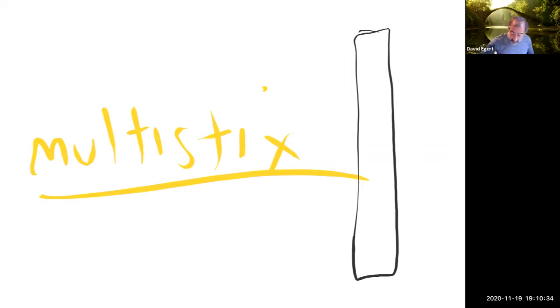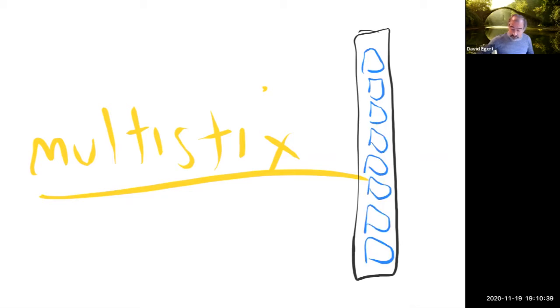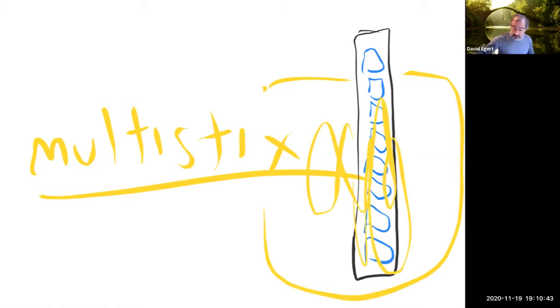It has all these little squares on it that measure different things, and you just dip it into your urine, then you pull it out and wait between 30 and 60 seconds. Each of the squares is going to give you a readout on some other property of your urine. It'll tell you about the glucose, or whether or not there's blood present, or what the pH is, or things like that.